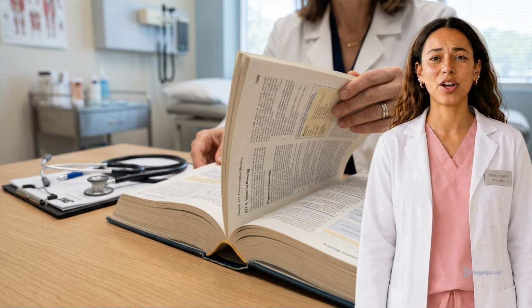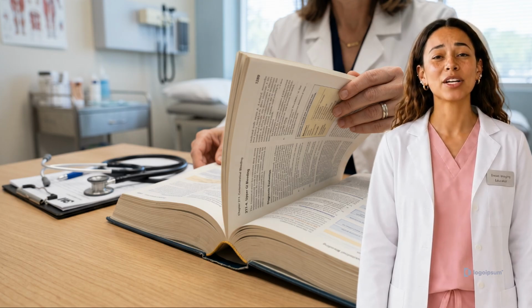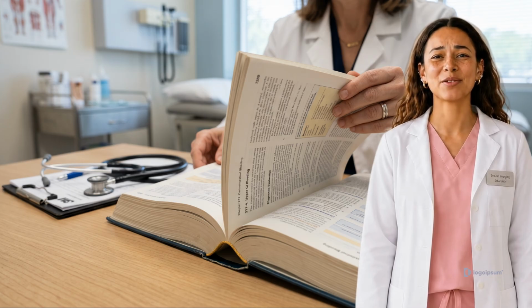Think of a 2D mammogram like looking at a closed book. All the pages are stacked on top of each other. A 3D mammogram allows us to flip through that book page by page. For patients with dense breast tissue, this page-by-page view prevents overlapping tissue from hiding small tumors or creating false alarms, leading to earlier detection and far fewer unnecessary callback visits.